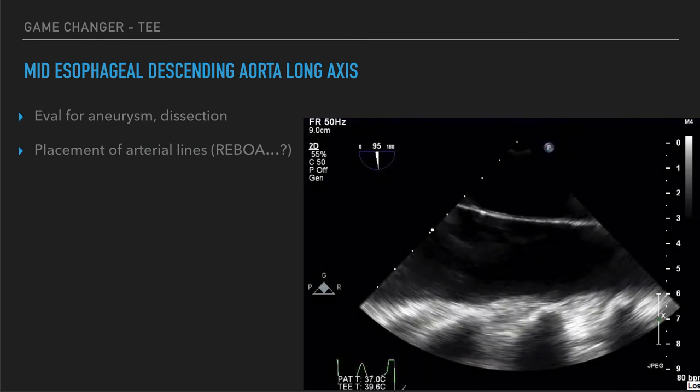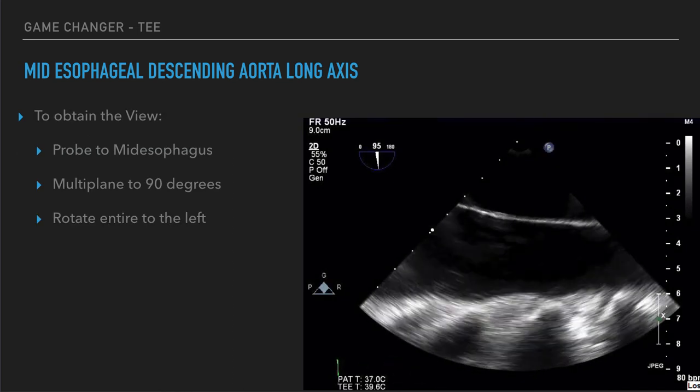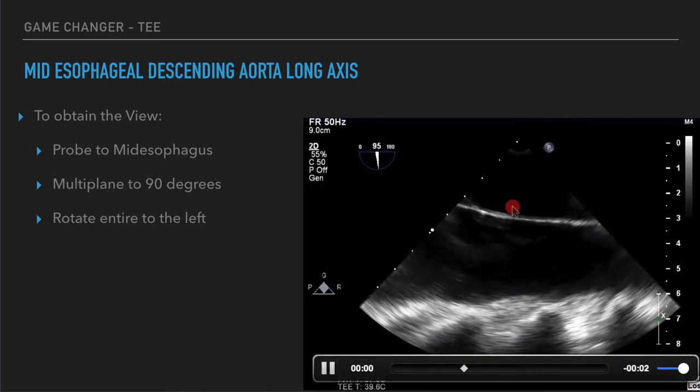The last view is the mid-esophageal descending aortic long-axis view — we get a view of the aorta itself in long axis. This potentially allows us to evaluate for aneurysm in the same way we use transabdominal ultrasound to look for a triple-A, and may enable more advanced applications such as placing arterial lines or REBOA. To obtain this view, stay at mid-esophageal depth, rotate the omniplane to 90 degrees, then rotate the entire probe handle to the patient's left to get the aorta. You can see the descending aorta at the top of the screen with the aortic wall visible.